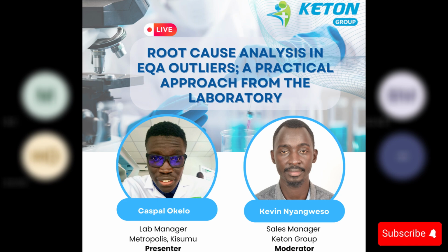If there's a gross difference between your unacceptable sample value and the peer mean, it means there might be a sample handling issue. But if it's a borderline difference, it might just be a statistical variation. In this scenario, the most likely cause is a sample reconstitution error. If it was lyophilized, you check: was the correct diluent volume used? Was the mixing complete?